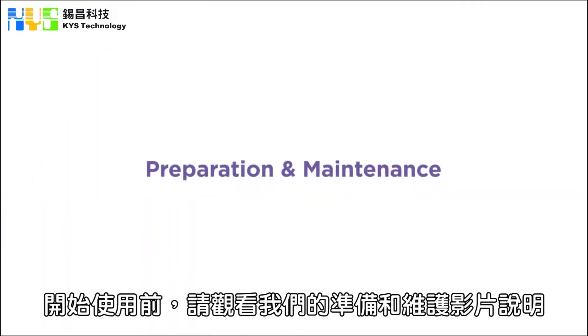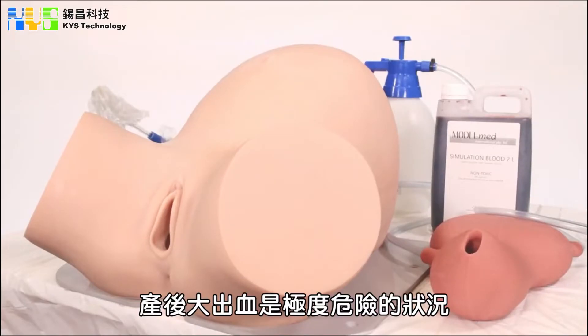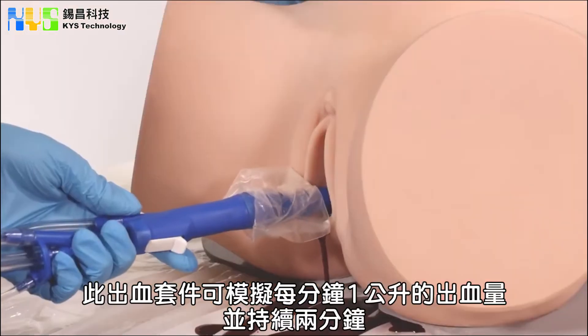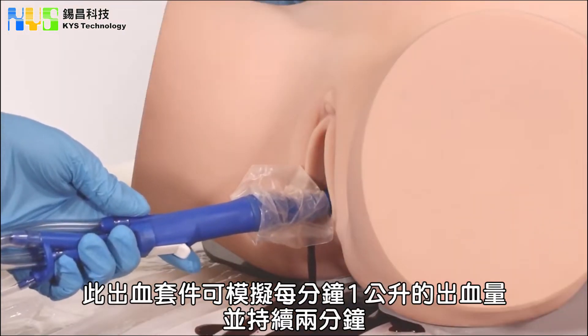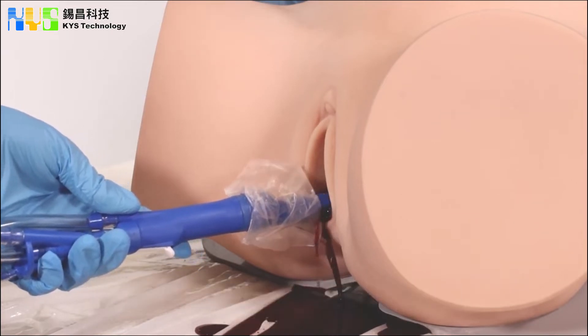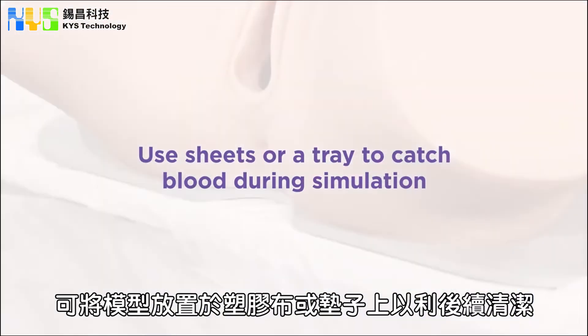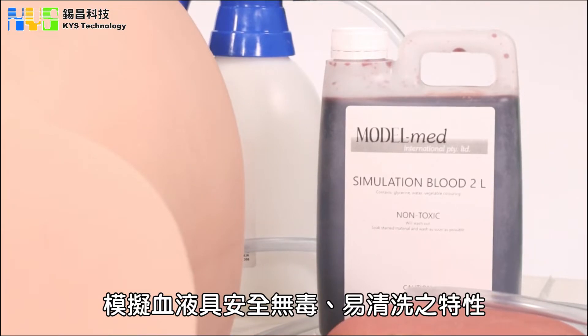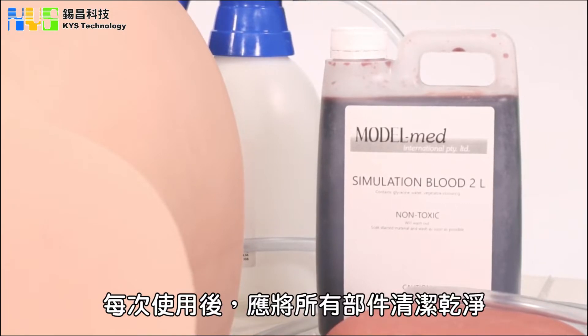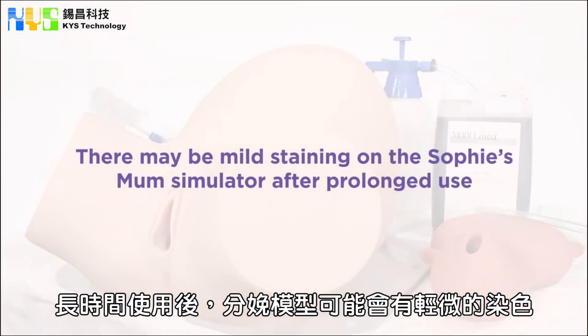Please watch our video on preparation and maintenance before attempting a simulation. A postpartum hemorrhage is a life-threatening situation. The Model Med Postpartum Hemorrhage add-on can simulate a blood flow of 1 litre of blood per minute for 2 minutes. We recommend running this simulation in an easy-to-clean environment and over a plastic sheet or tray. The blood we use is non-toxic and washable. You should also wash your PPE after use. There may be mild staining on Sophie's Mum Simulator after prolonged use.